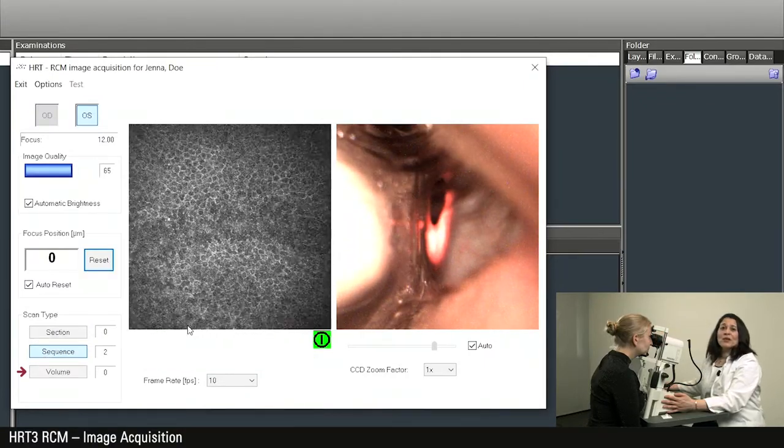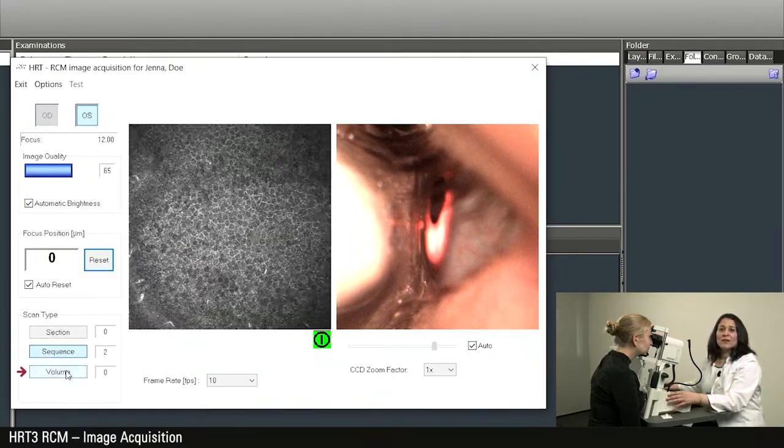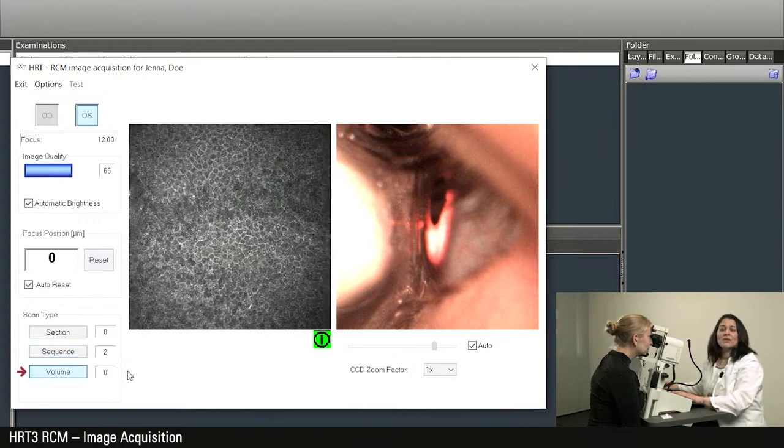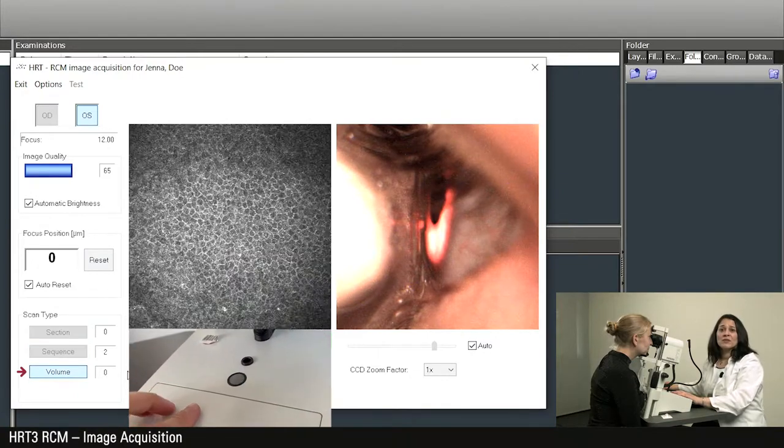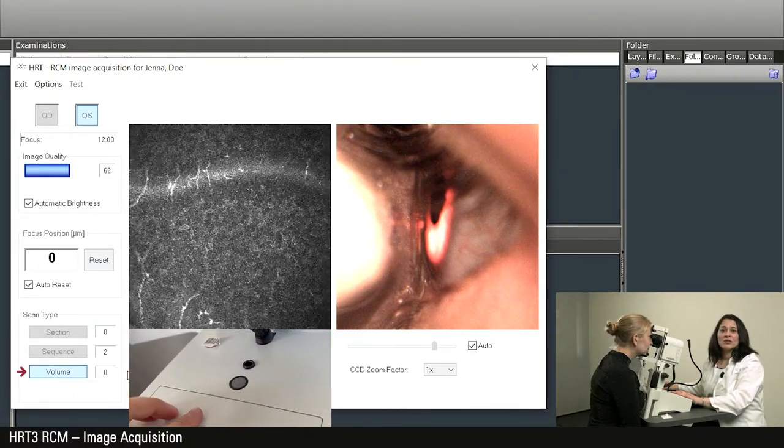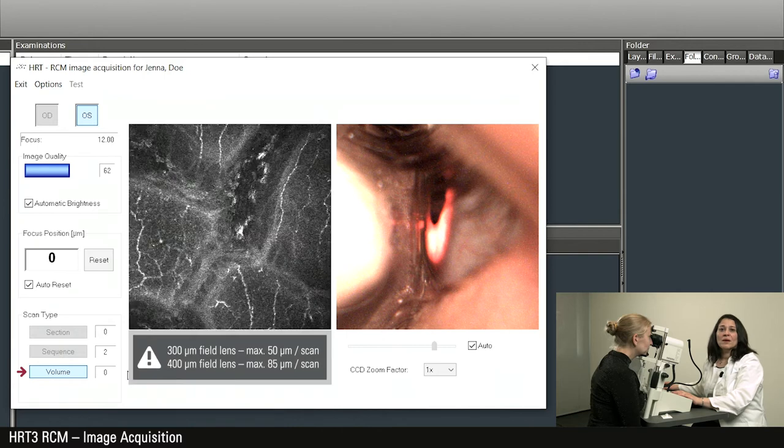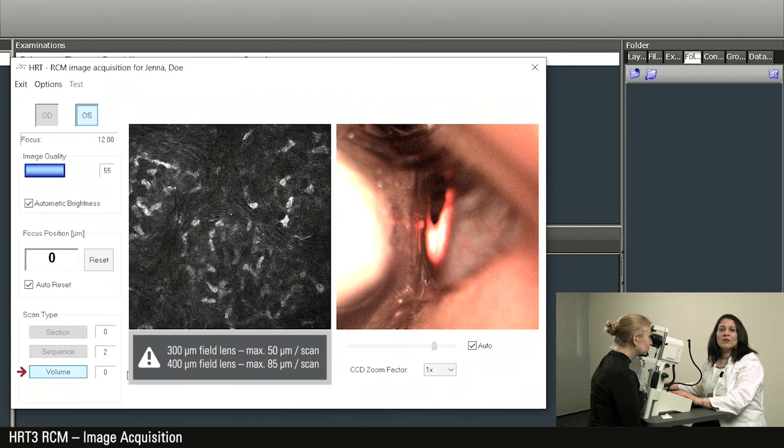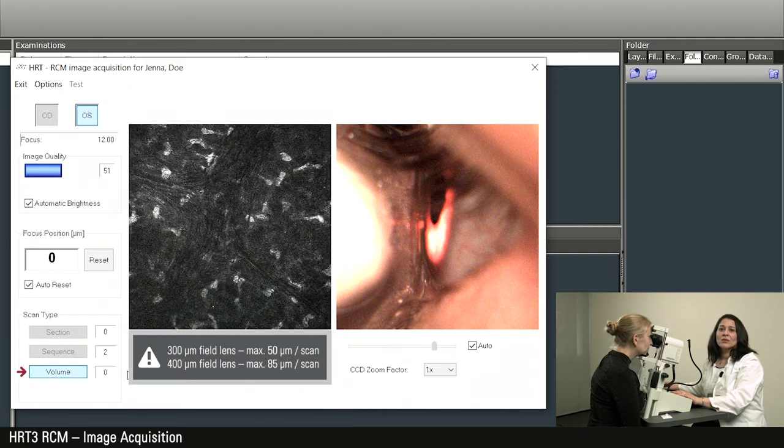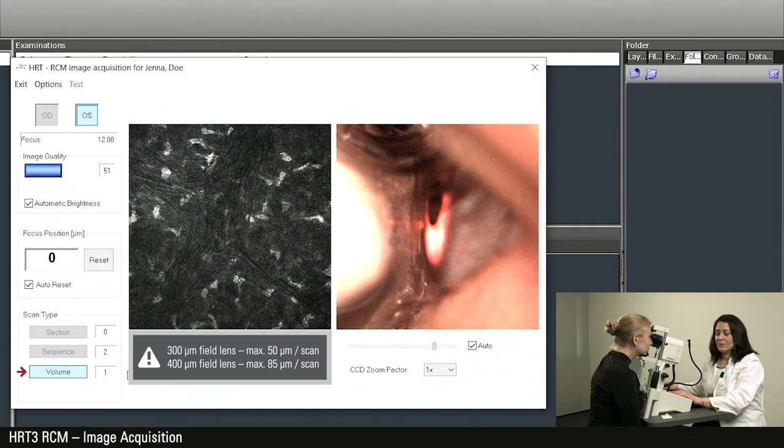The third recording option is volume. After pressing the acquisition button, the RCM independently records a film and adjusts the focal plane to the depth. When using the 400 micrometer field lens, a total depth of 85 micrometers is scanned.